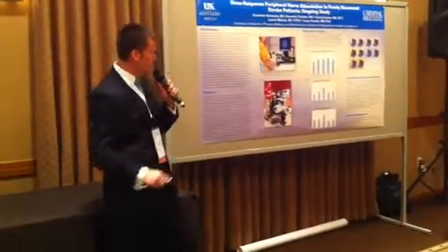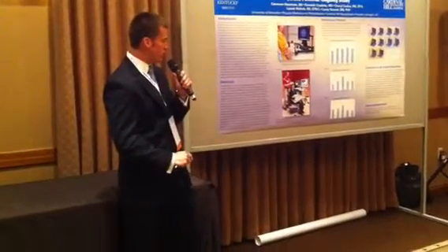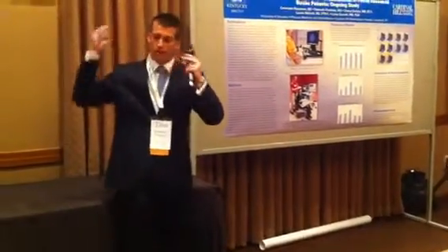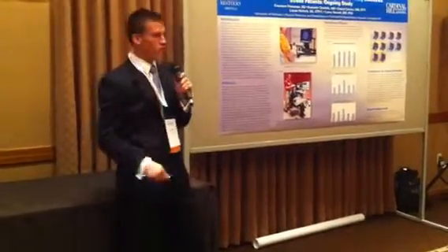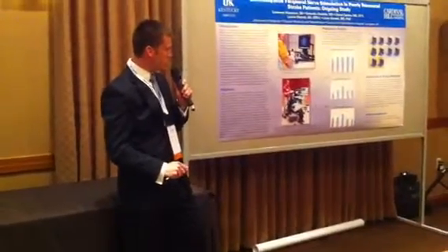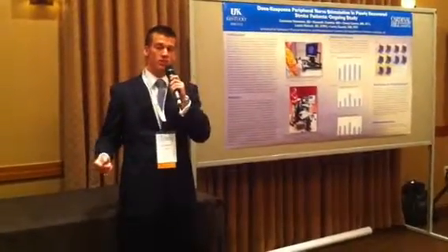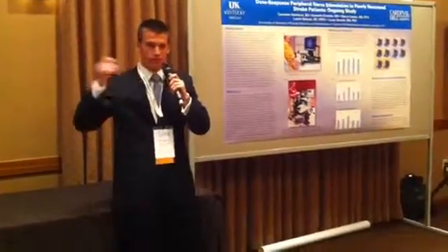And it allows us to have a co-registration between the patient and this computer software system that we see up here, which is a BrainSight 2 from Rogue Research in Canada. That allows us to place a virtual grid over the patient's head that corresponds to the EEG 1020 system. And so as the evaluator, I can move the coil from spot to spot on the patient's head, and we have monitoring electrodes placed on our target muscle, which on this computer screen we see the motor evoked potentials, MEPs, which is essentially a muscle response that is elicited by the transcranial magnetic stimulation.